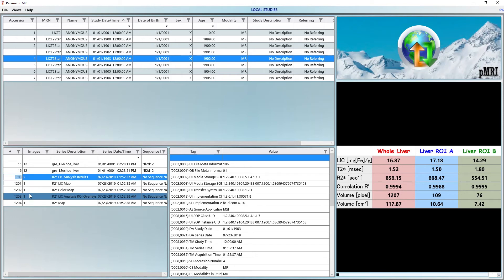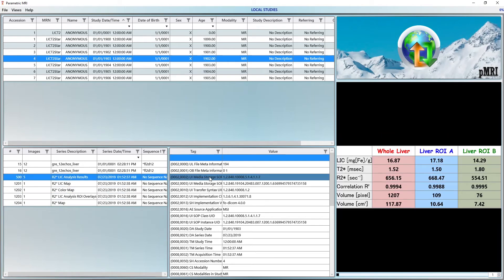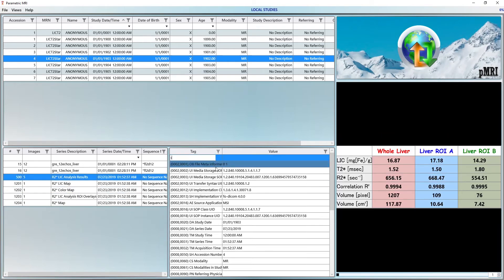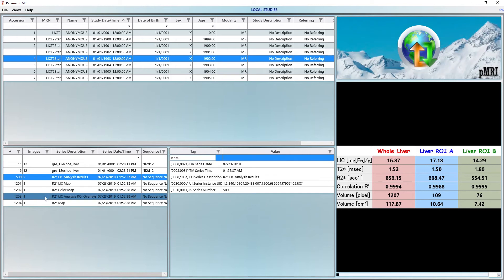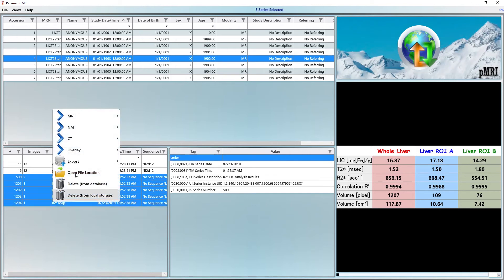Double click on any value you want to change, enter a new value and press enter. The DICOM files are automatically updated. To send them to PAX, right click on the selected series and choose your destination from the export menu. This is covered in greater detail in another video.